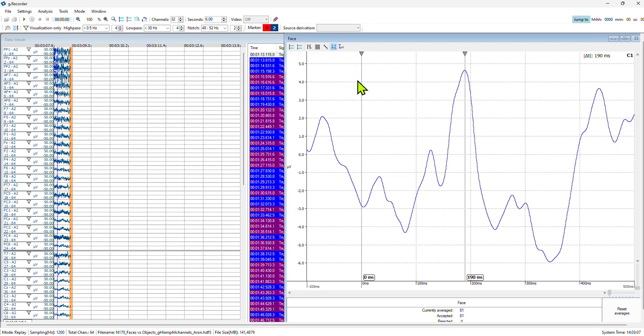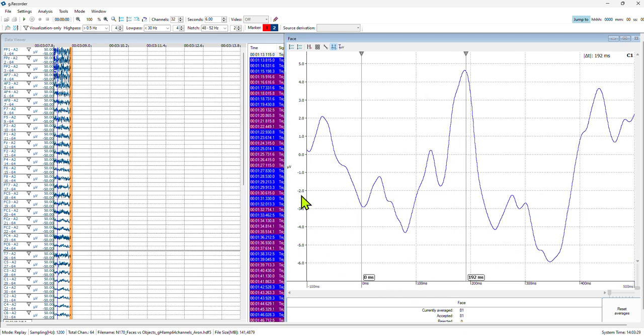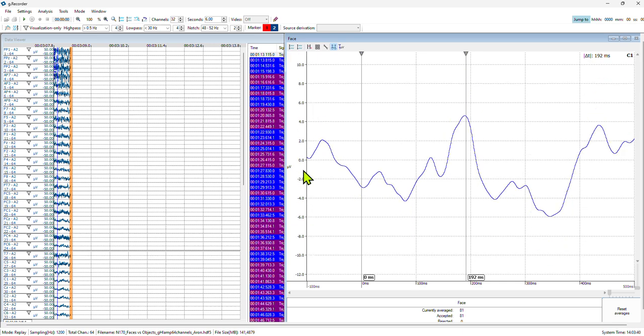Leave the first marker at 0, then you can measure the difference just by dragging the second one. And again here, you can perhaps zoom in to the peak. On the time base, come out with a double left mouse click, and likewise, let's say this is a bit big, so I want to make it smaller, so I will press and hold the right mouse button and go up slightly, and now I have a better view of the whole evoked potential.